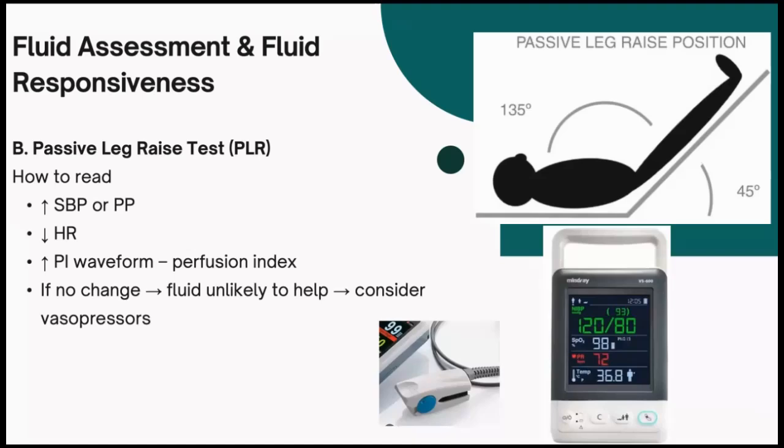During expiration, there is a positive intrathoracic pressure, so again there is a pressure difference. With that, you might see a waveform alteration of the pulse oximeter. That is an indicator there is a volume gap. If there's not much alteration with breathing, probably the patient is well filled.